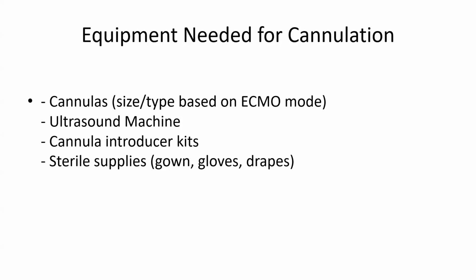And you should also have one size and two sizes down below the cannulas that should be present. We need to supply gloves and drapes. So before we check the ultrasound and we do the sterile preparation and draping.